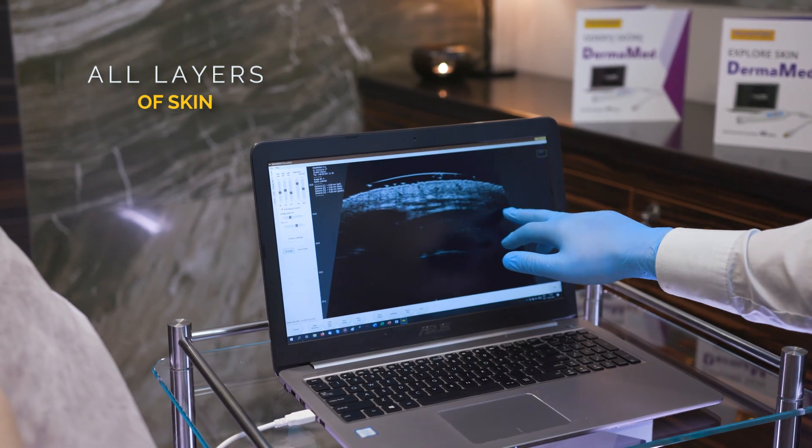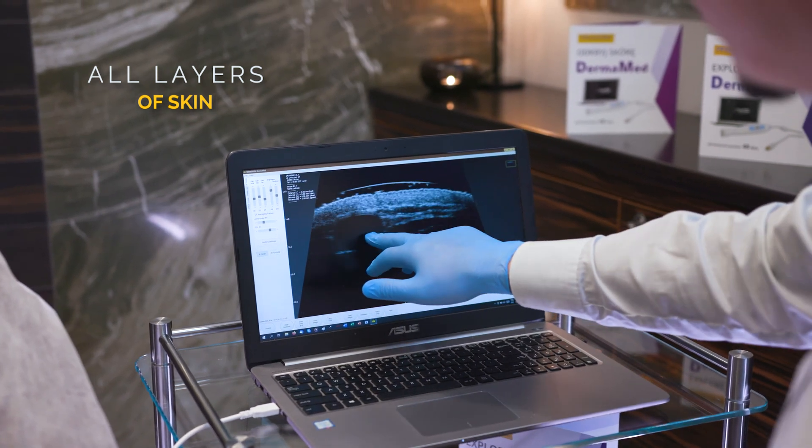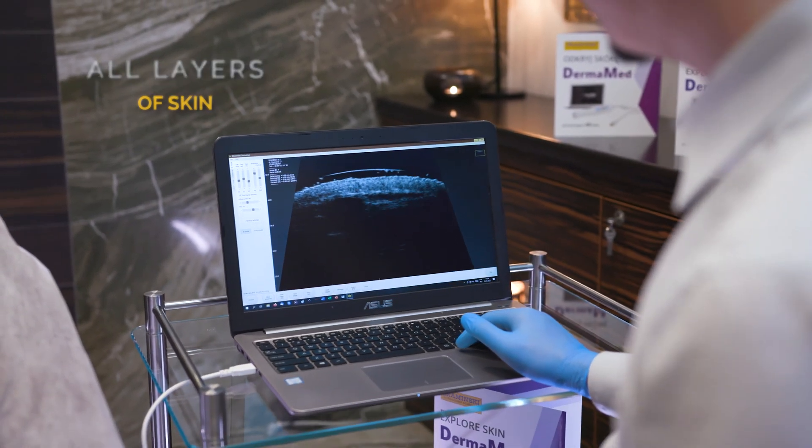And underneath there is subcutaneous tissue. This dark area which we can see here is a vein in cross section.